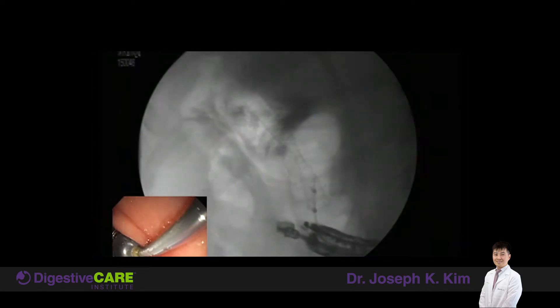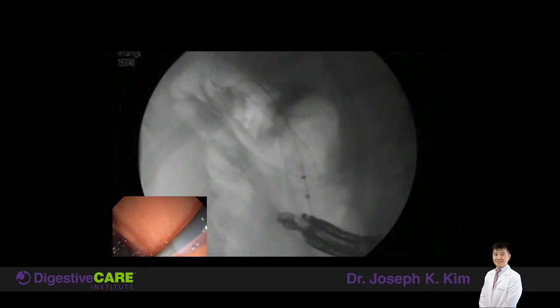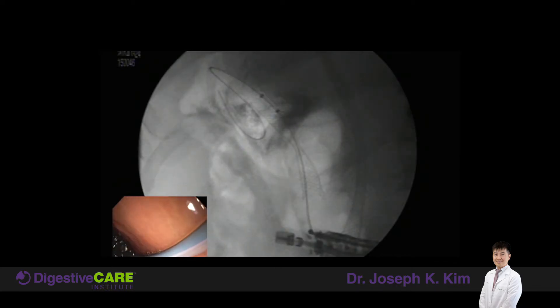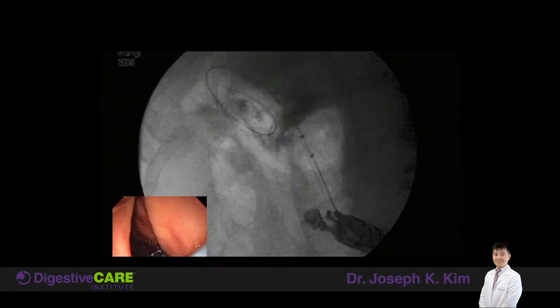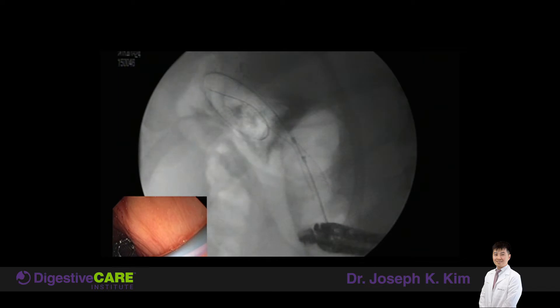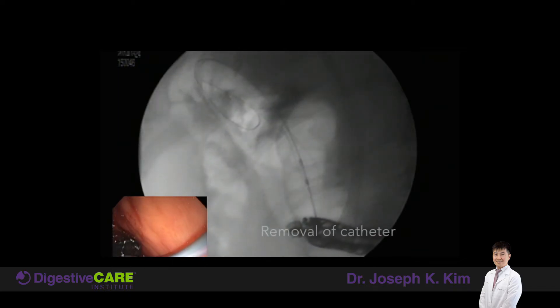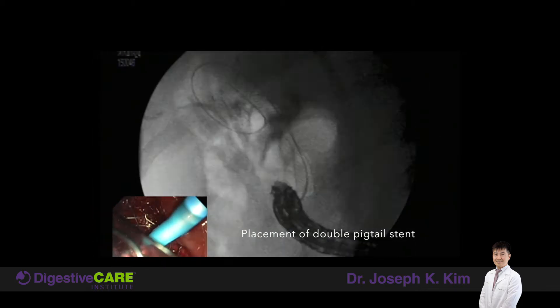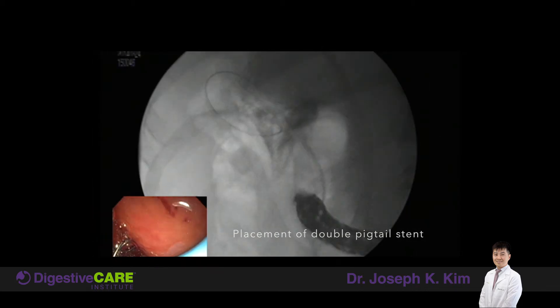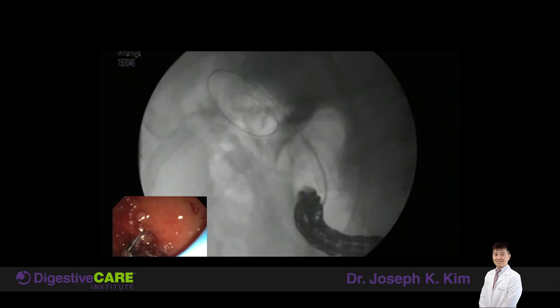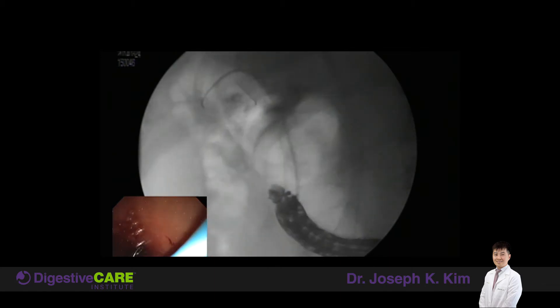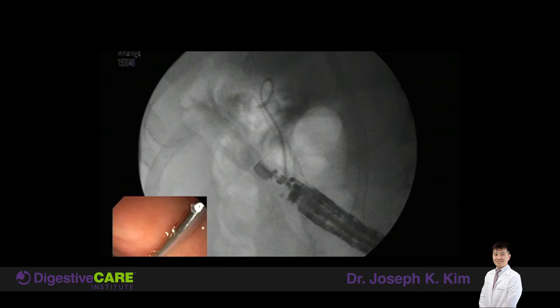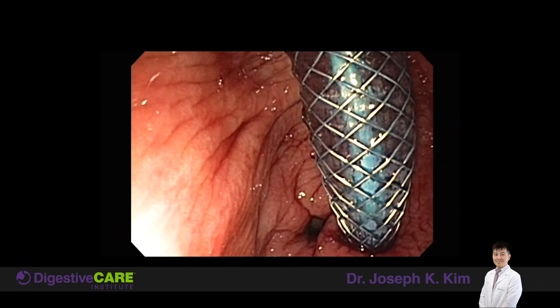You can see the stent — it kind of looks like an hourglass shape. One part of the stent is sticking out into the stomach lumen; the other part is going into the biloma. This is the wire going through the stent. The reason I'm putting the wire through the stent here is that I can place another plastic stent through the metal stent that will pigtail, so it anchors the metal stent and prevents it from migrating out of or falling into the stomach. You see the blue stent within the metal stent.